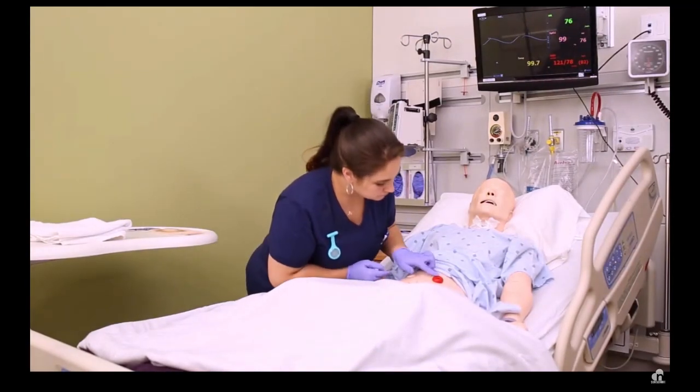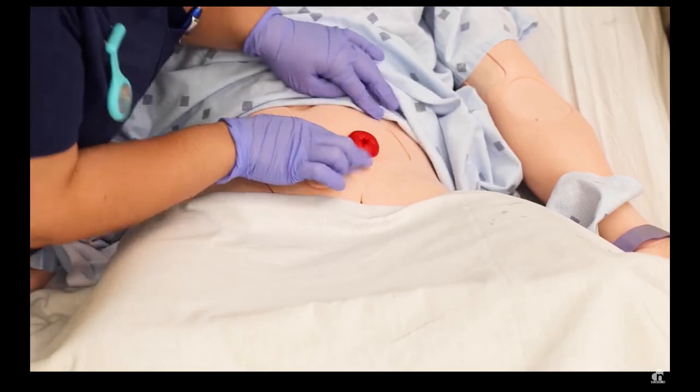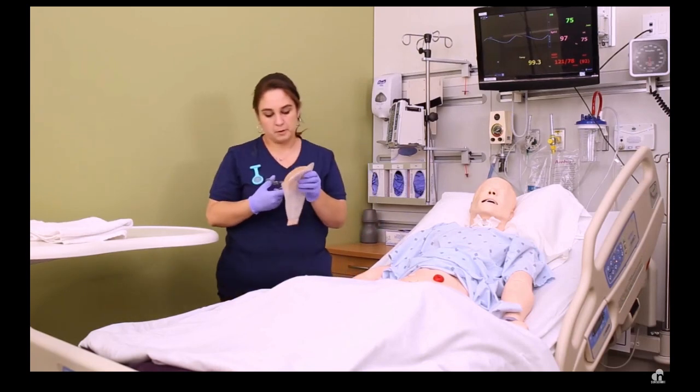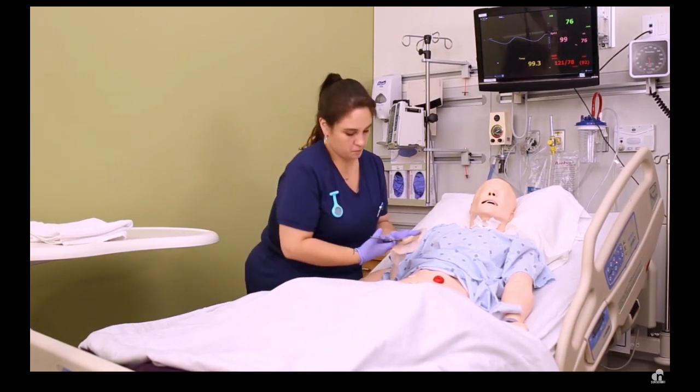So you want to inspect the stoma itself. It should be light to dark pink and moist. What you don't want to see is dark red, pale purple, or any kind of bluish color. None of those are good signs. They all represent problems with perfusion and should be reported right away. And of course, look for any skin breakdown.